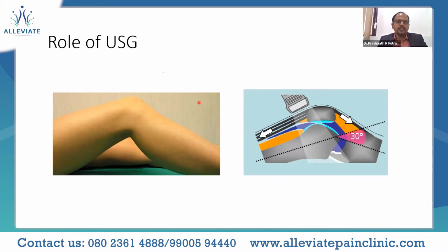So before actually starting the presentation, when do we start scanning the patient? The importance of taking a proper clinical history and the clinical examination of the knee is of paramount importance, only after which we should jump into the next step of examination, that is the ultrasound, that is scanning the knee.